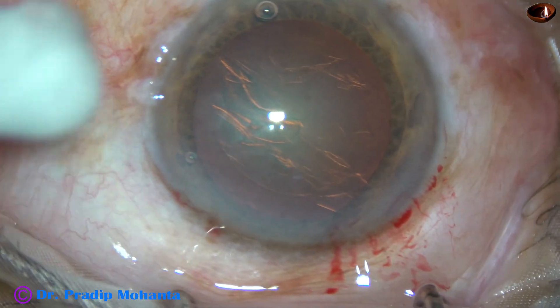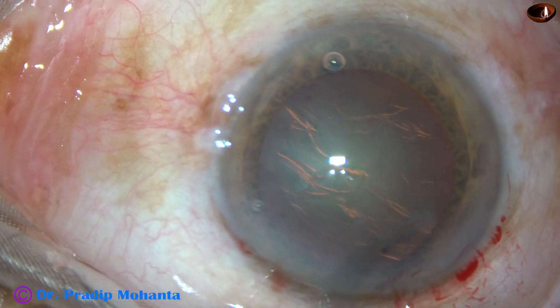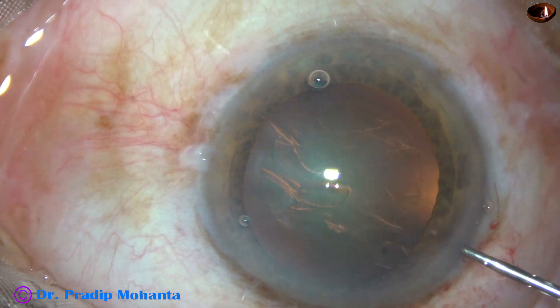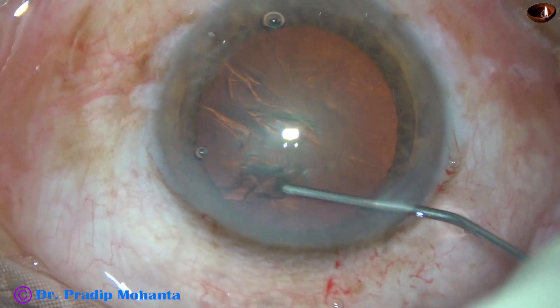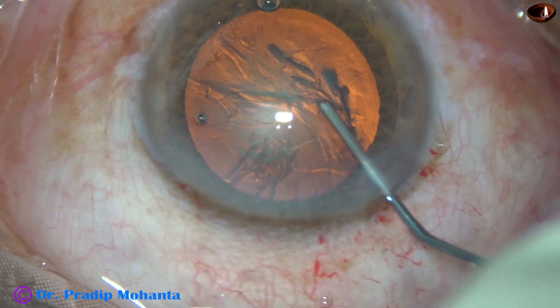And now hydrodissection is to be done. I use a 27-gauge cannula and BSS to do hydrodissection. Here it is. The fluid wave goes to the opposite equator. The nucleus is stabbed and the nucleus is mobilized.